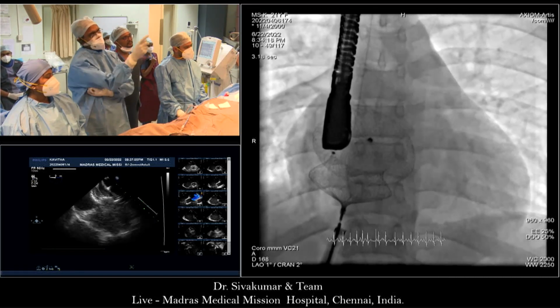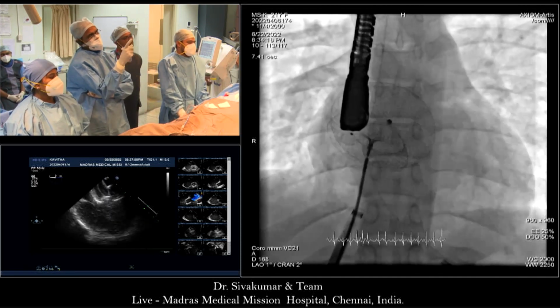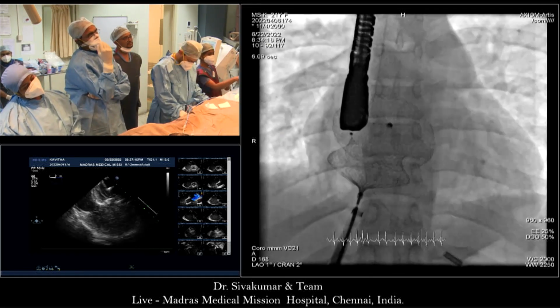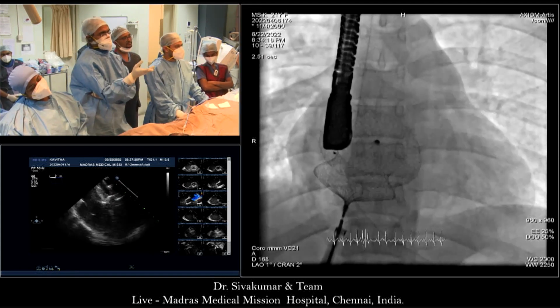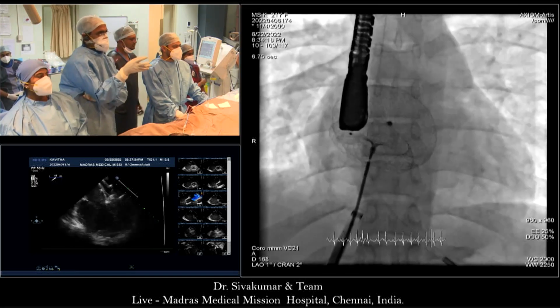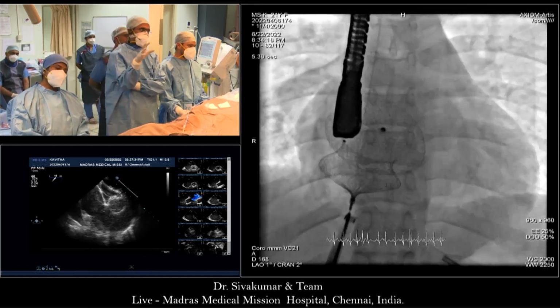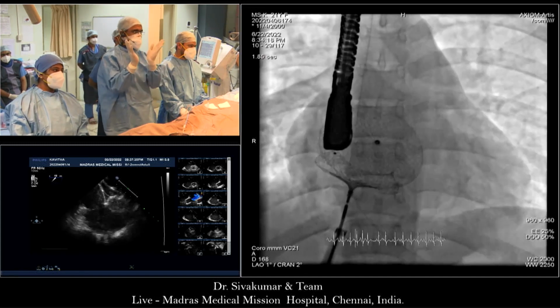You can now look at one of the pictures. It's only at the anterior margin that the LA disc and RA disc have separated. In all the other places, the posterior, postero-inferior, and inferior, the device is in total contact. LA disc and RA disc are in contact. That means that the device is optimally sized. If the patient has an absent retroaortic margin, it has to flare on the aortic end. So that is the only place where it is flat.